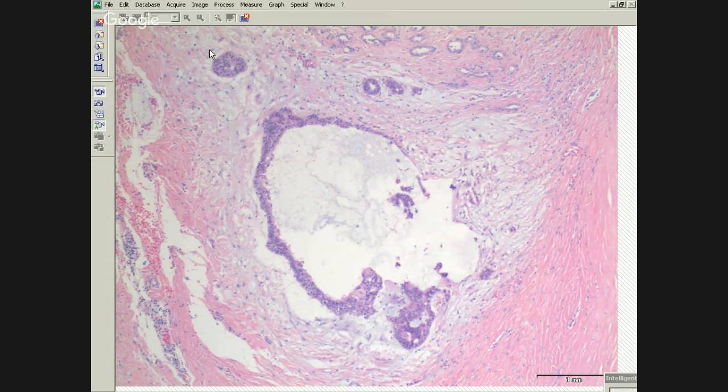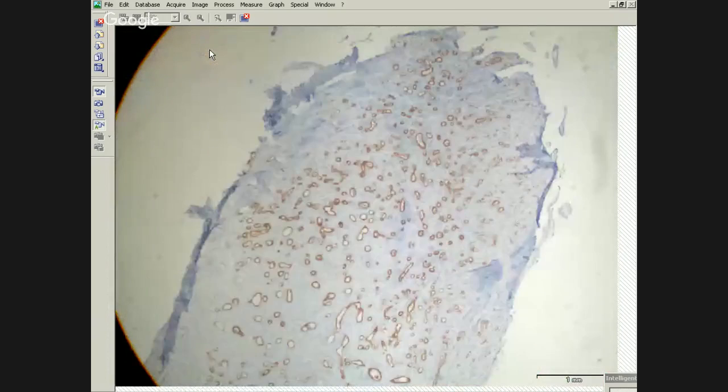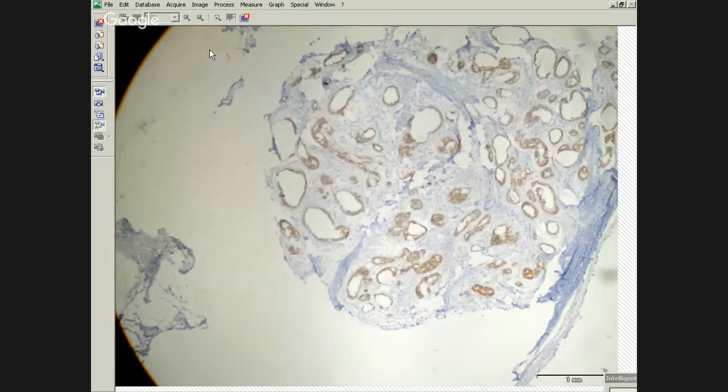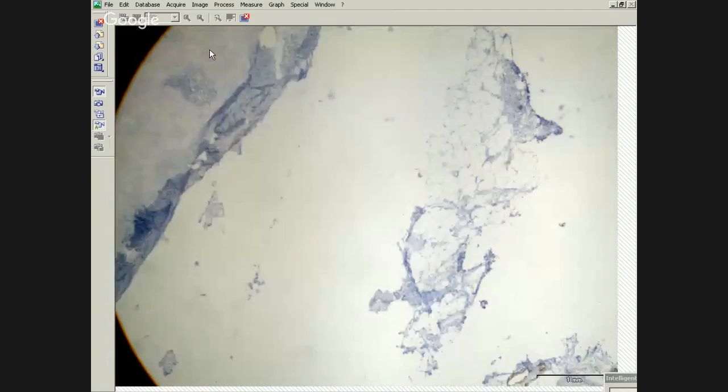And if we look at our calretinin stain for this one, you can see that it's brightly positive. And this one's stained for all of the other mesothelioma markers as well. And this is that quote unquote mucinous looking area. So this is a mesothelioma. So you don't want to skip doing your stains, even if something has a lot of what appears to be mucin, or even, like I said, if it has a signet ring pattern, sometimes mesotheliomas can look like that. So you really want to make sure you don't skip your stains when you have a pleural biopsy.